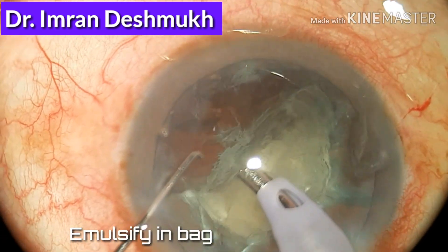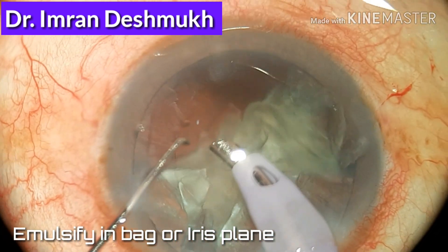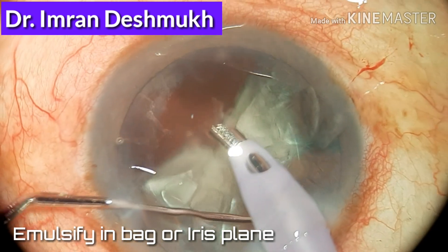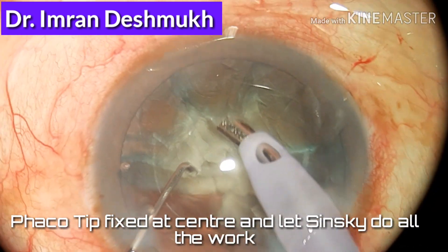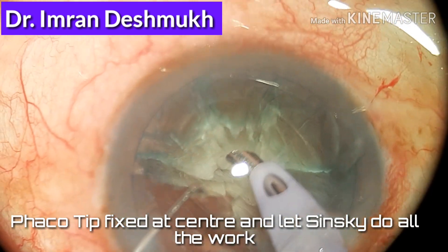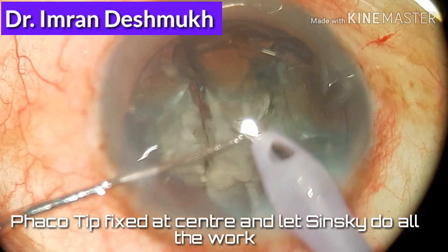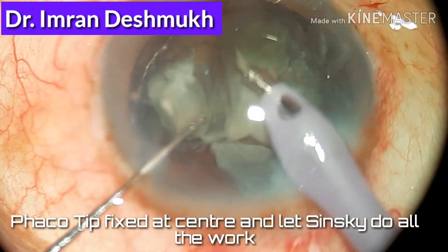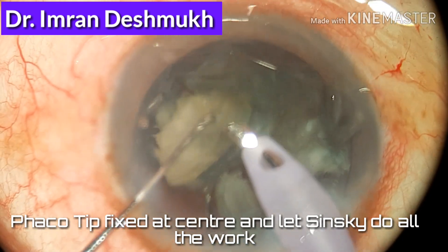I usually keep the bevel tip sidewards — you can also keep the bevel tip downwards — and emulsify the nuclear fragments. You can emulsify the nuclear fragments in the bag or in the iris plane. I usually use the iris plane for emulsifying. The phaco tip should always be fixed in the center.